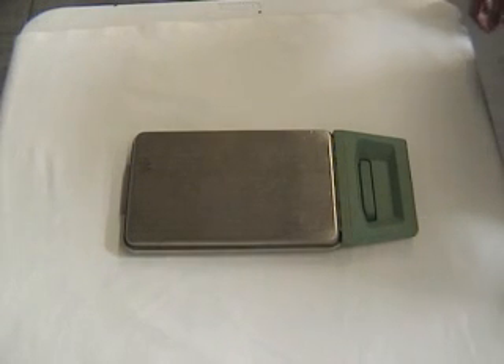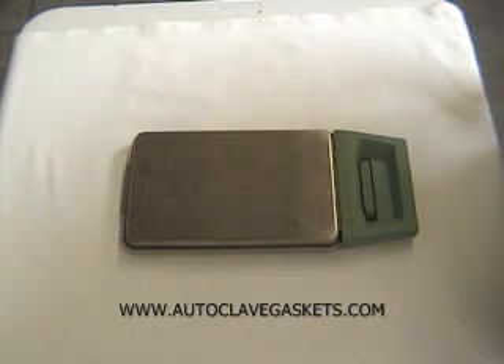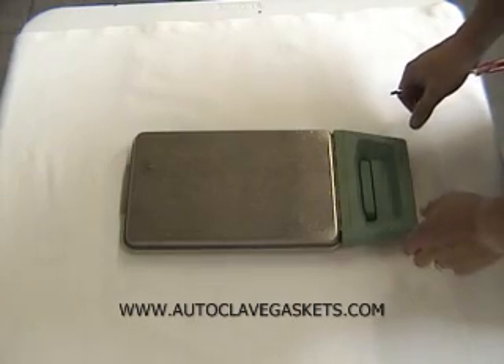Today we're going to demonstrate changing out the gasket on a SkyCan Statum Sterilizer. This is the cassette for a Statum 2000, but the Statum 5000 is nearly an identical design, just a larger cassette, so this should serve for both.